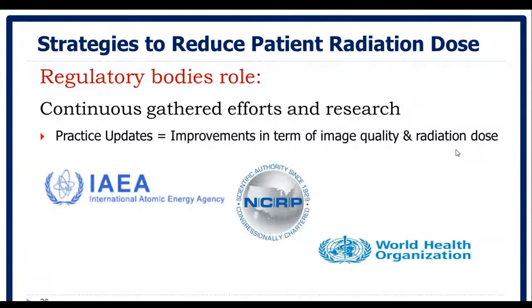And always, even in our practice for any given CT facility, we need to refer to the recent published information about image quality and radiation dose, published internationally, in order to update our practice based on this. Because we may have, for example, manuals from 10 years ago that are now out of date. We need to update these manuals based on the current advances and recommendations by the regulatory bodies.